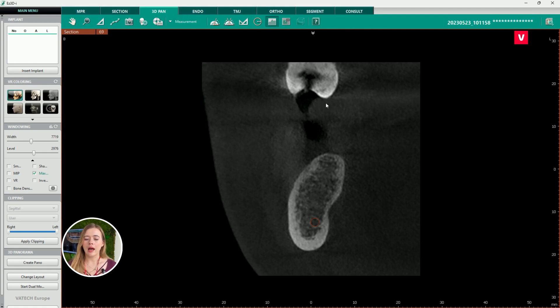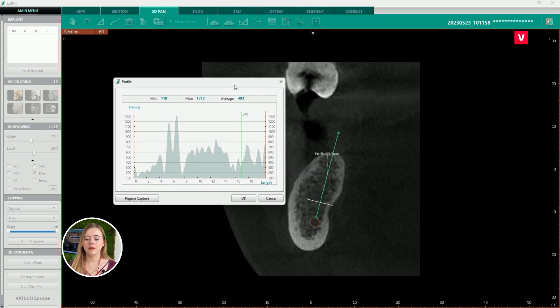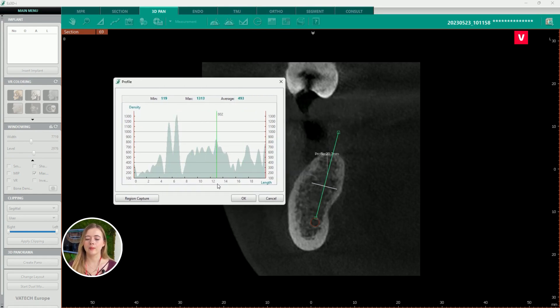We will draw a line along which we can measure the bone density. A graph will appear where we will get all the necessary information needed for determining if the patient is suitable for an implant.